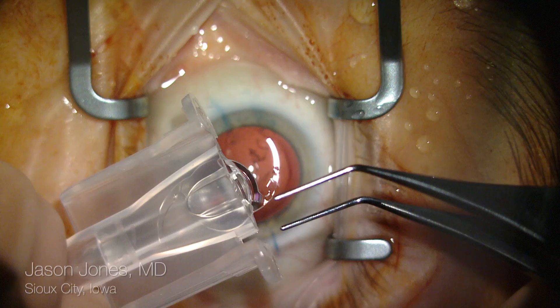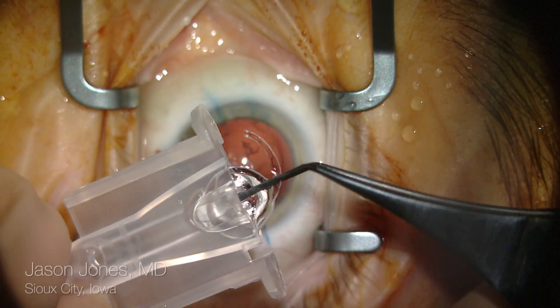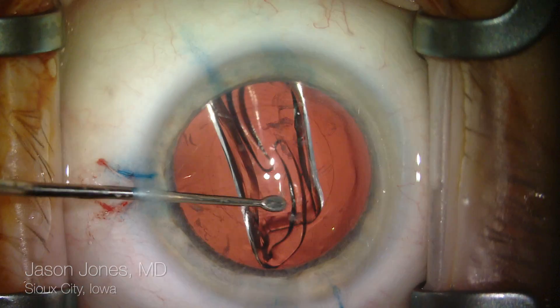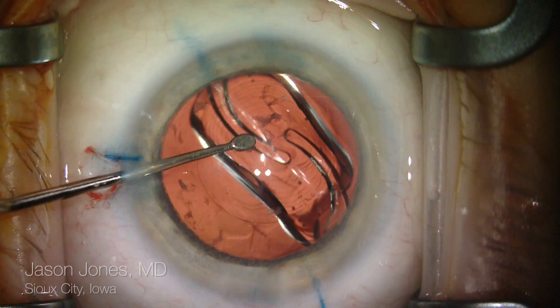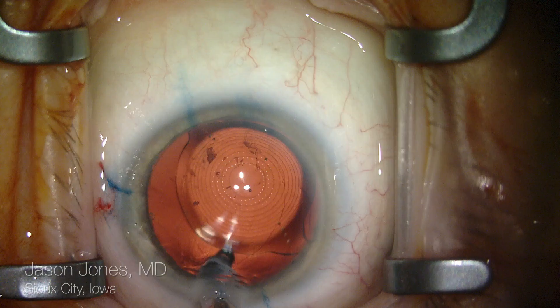I like to load my own lens in the cartridge. I find this gives me a sense of security in terms of how the lens is delivered, and then using a two-handed technique with assistance from my scrub tech.